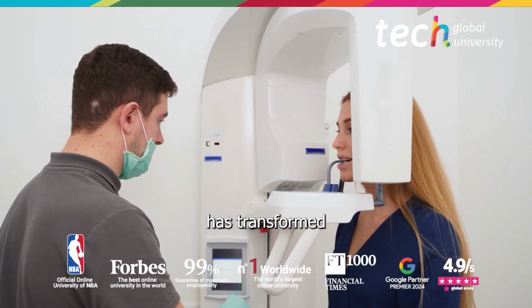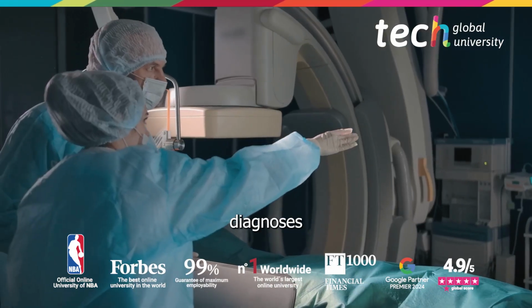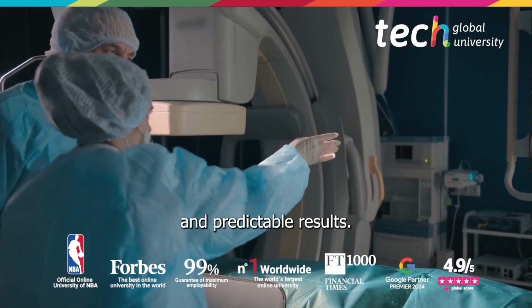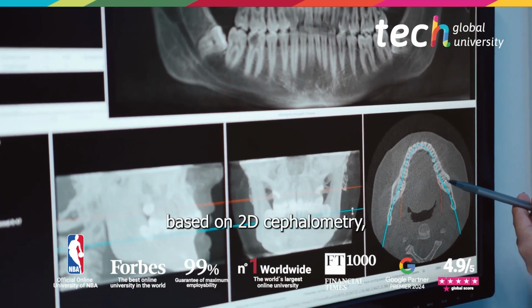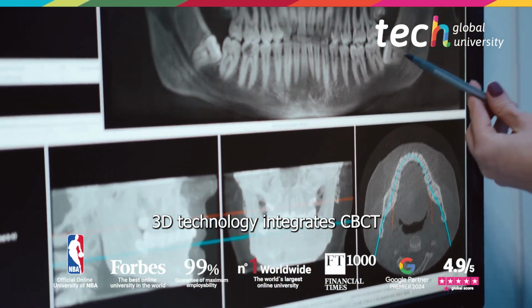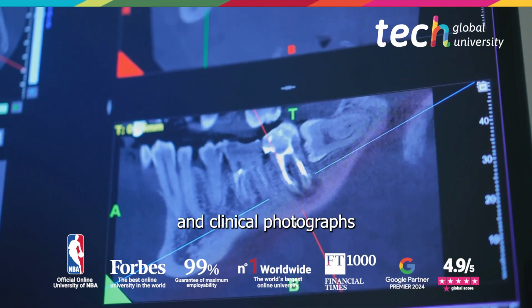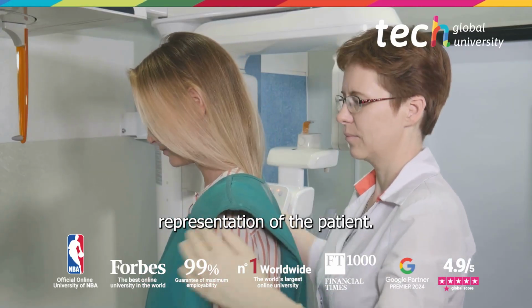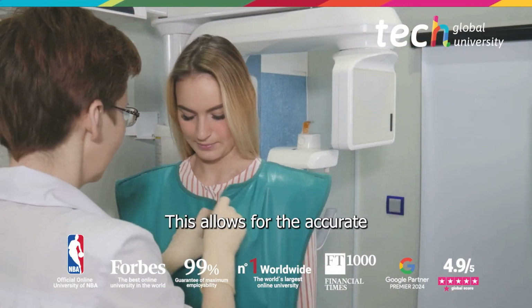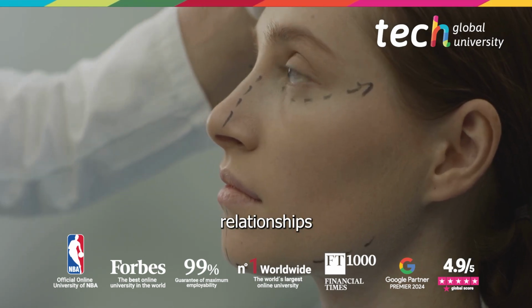Three-dimensional planning has transformed orthognathic surgery, enabling more precise diagnoses and predictable results. Unlike conventional methods based on two-dimensional cephalometry, three-dimensional technology integrates CBCT images, intraoral scans, and clinical photographs to generate a complete representation of the patient. This allows for the accurate analysis of bone, dental, and soft tissue relationships in all three planes of space.